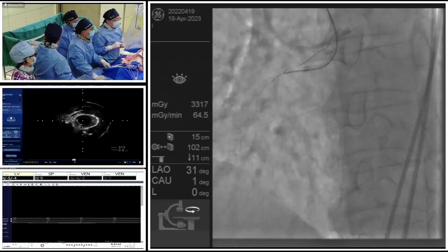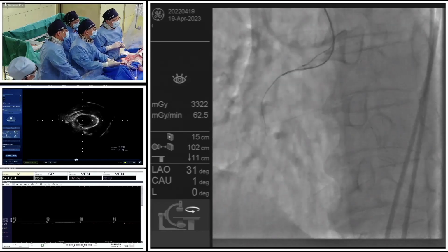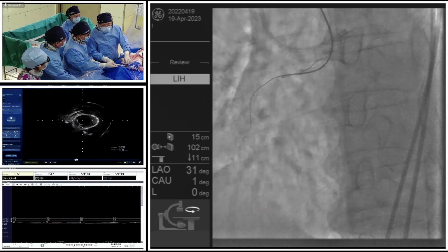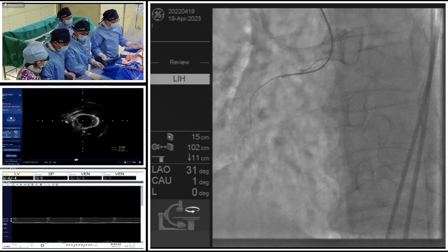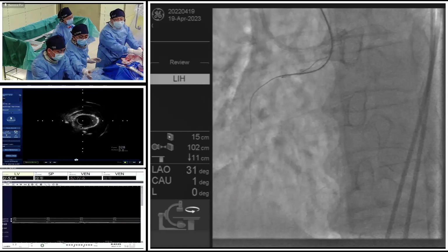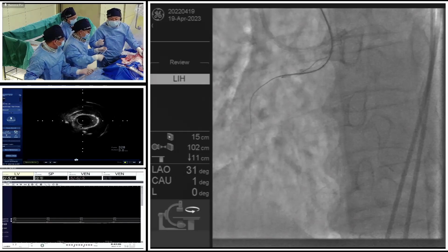So Professor Li, what do you think about the ADR for this patient? Is this a good choice or not? Yeah, certainly we could try ADR. But the CTA showed us, and also the bilateral angiogram, we can see the plaque burden is relatively high.